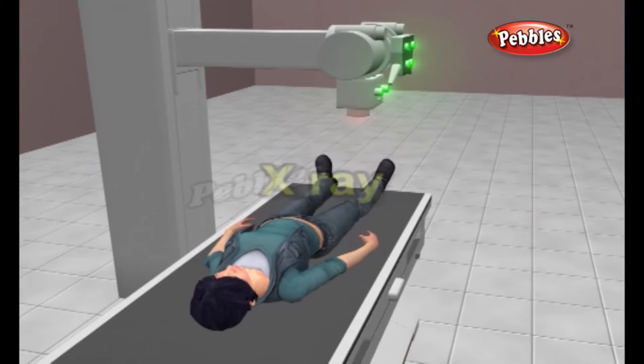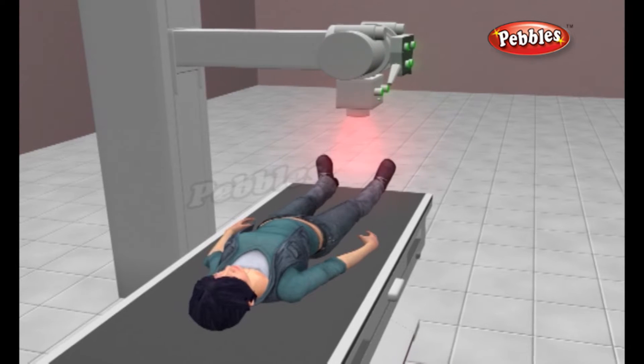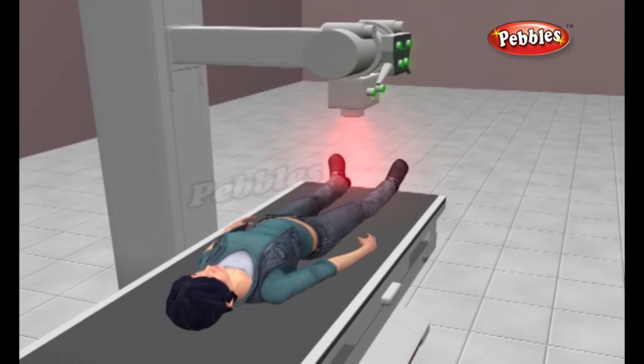X-ray. X-rays are basically the same thing as visible light rays. Both are wave-like forms of electromagnetic energy carried by particles called photons.